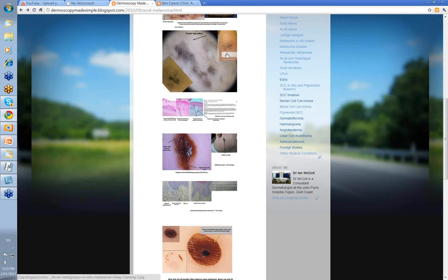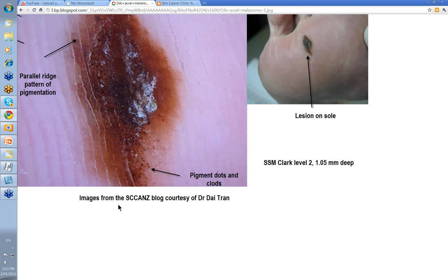Another one from Dr. Dai Tran from the blog. Clinically, I don't think you have any doubts that this is a melanoma. Looking at it dermatoscopically, again your parallel ridge pattern with your furrows. This one also had some pigment dots and clods in there as well.